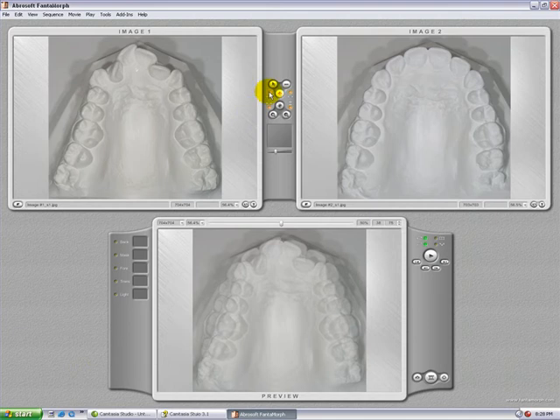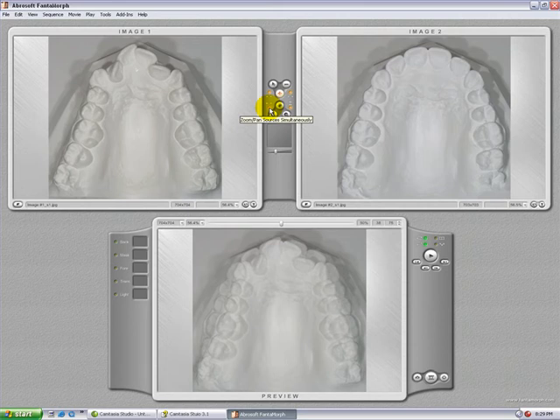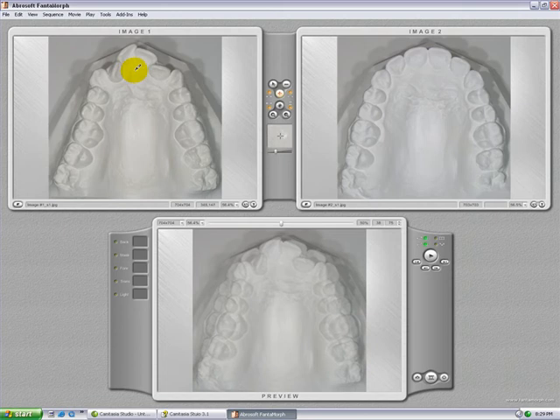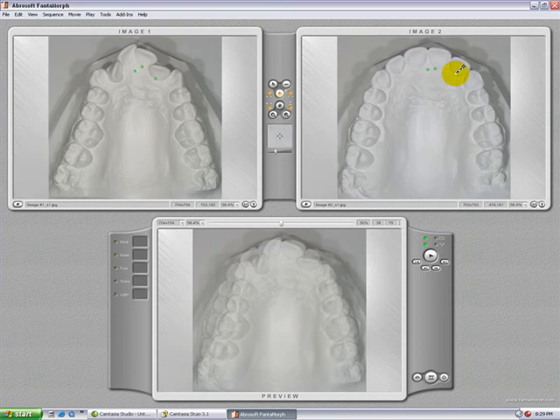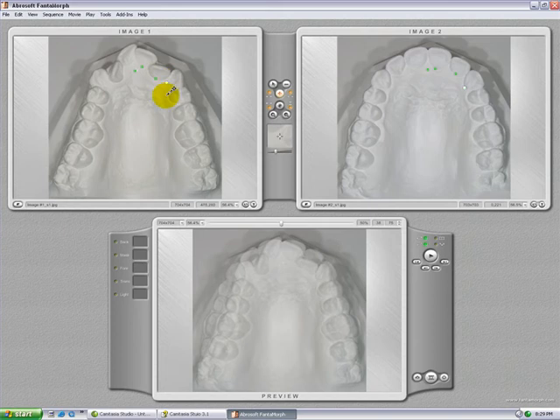Make sure that the options auto add and auto jump are selected. Also, simultaneously zoom and pan for both images should also be selected. As soon as you move the cursor to the image, it will change into a pen. If you click with your mouse, a green dot will appear, and the cursor will jump to the other image — that's the function of auto jump. You can then add an extra dot, and it will jump to the other side.